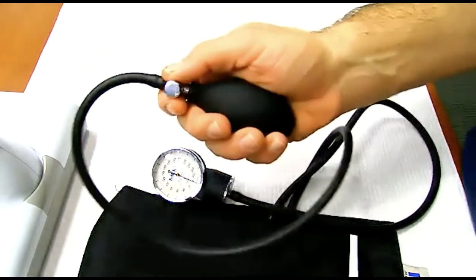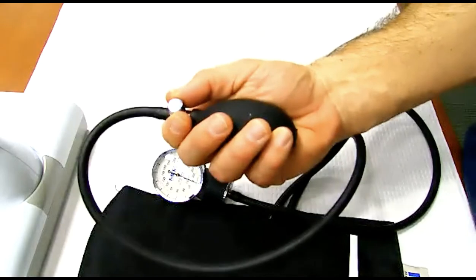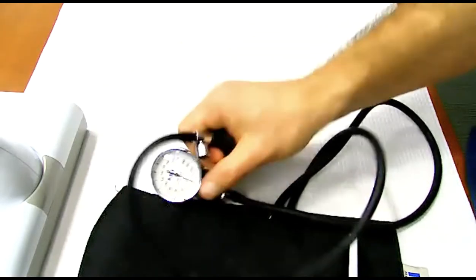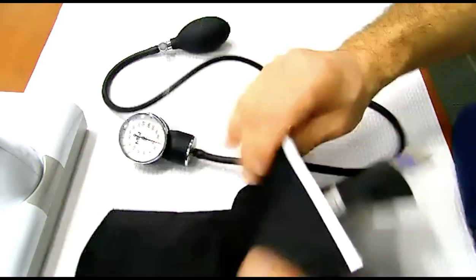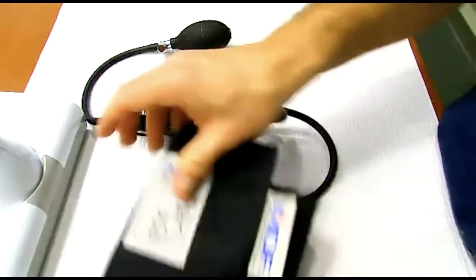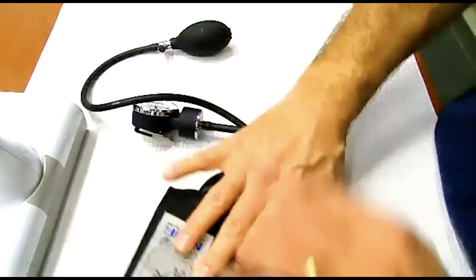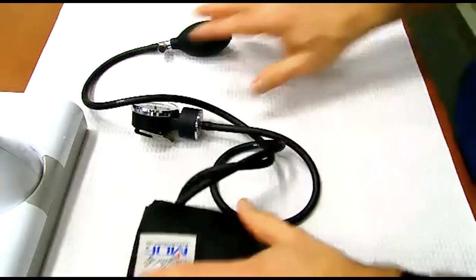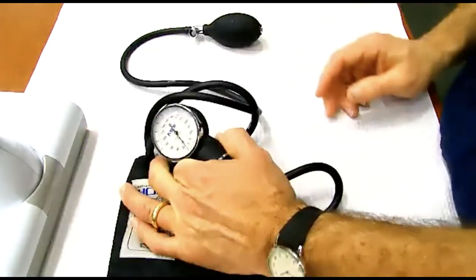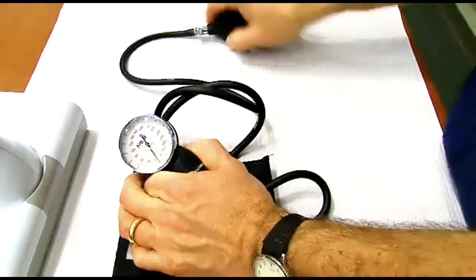So if you can get used to doing it this way, it's, I think, the way it was intended, and it's a lot easier to do. So hold it where the bulb valve is right there, okay? So let's see if this works. Let's take the cuff for now, and I'll talk more about the pieces here, but let's wrap it around a couple of times. So take this and wrap it around where it's flat, and put your hand on it because it won't inflate unless you've got some pressure on it. I'm going to hold my little pressure valve here so maybe you can see, and I'm going to lean on this. You can try this too.